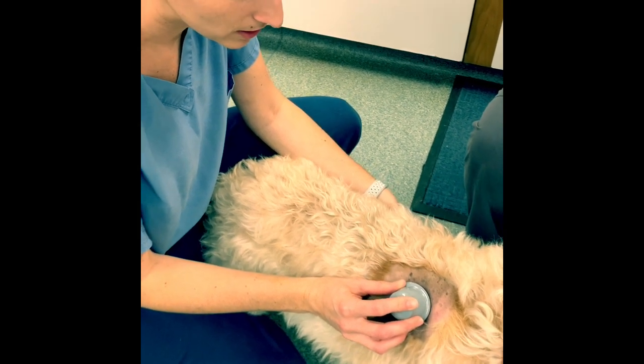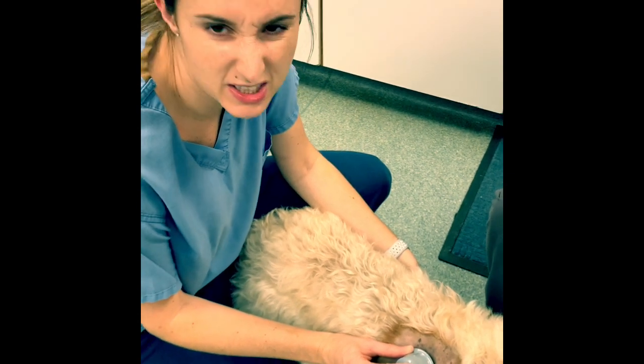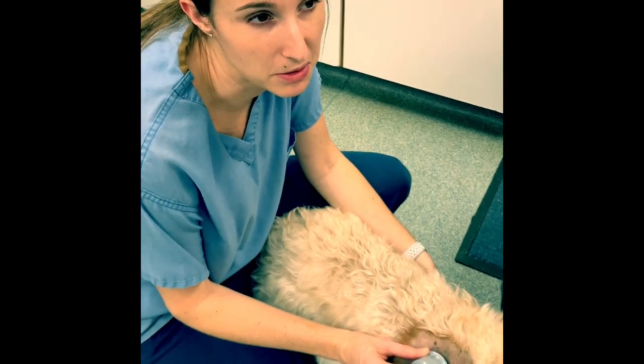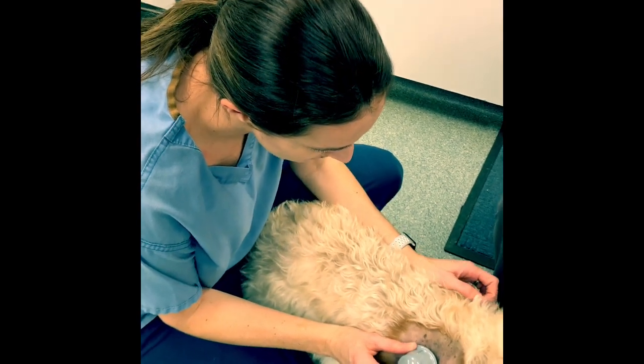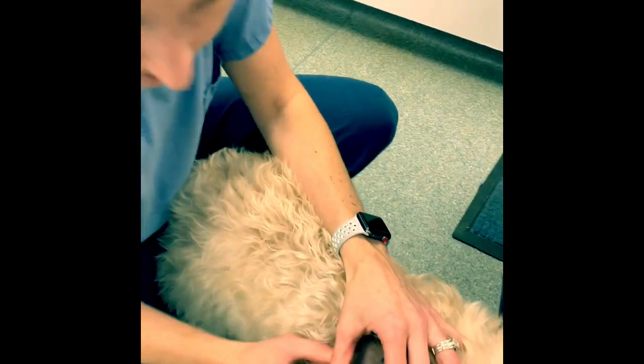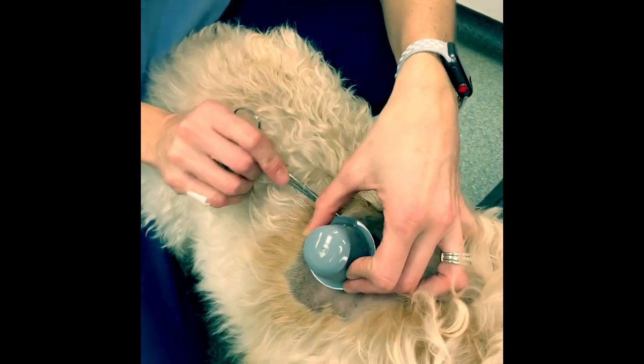These sensors are not going to be accurate for about the first 12 hours, so we're putting it on today. I told mom she could take some measurements tonight just to see how it goes, but we're not really going to start using it from a measurement standpoint until tomorrow.